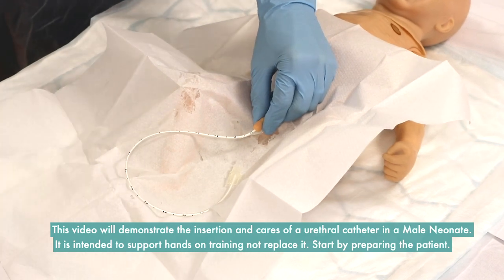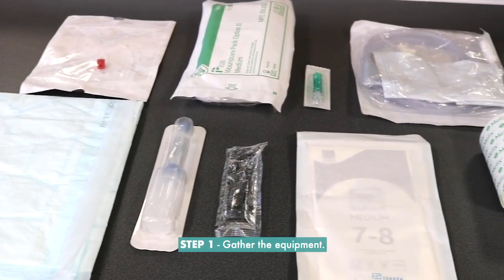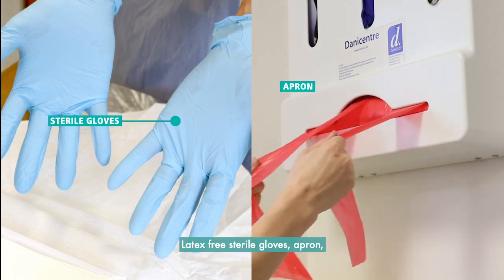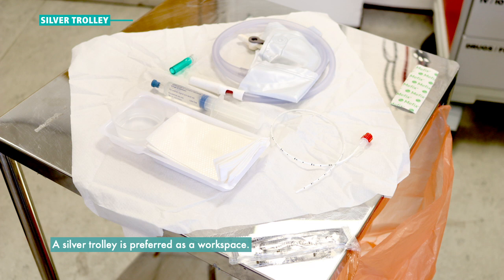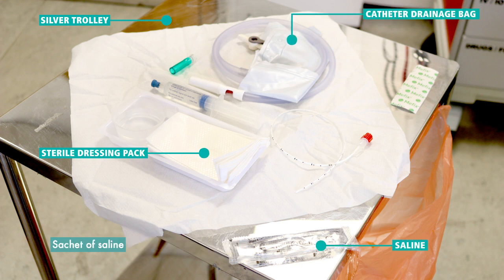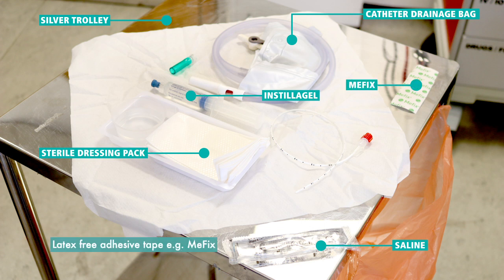Start by preparing the patient. Step 1: Gather the equipment. You will need latex-free sterile gloves, an apron, and a silver trolley as a preferred workspace. You will also need a sterile dressing pack, a catheter drainage bag, a sachet of saline, water-based anaesthetic gel such as Instillagel, latex-free adhesive tape such as MeFix, and an absorbent pad such as an Incopad.